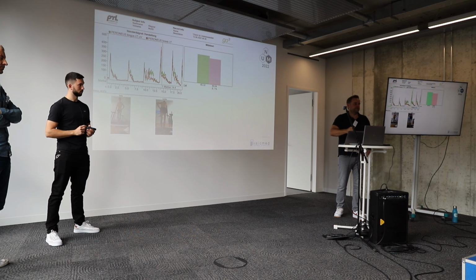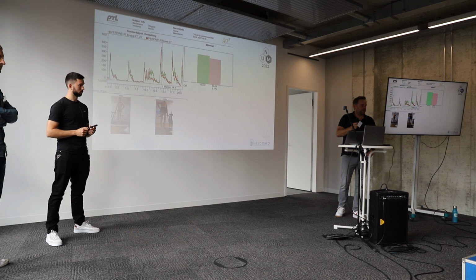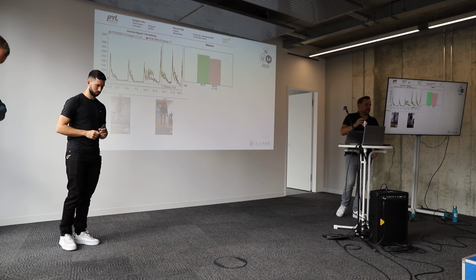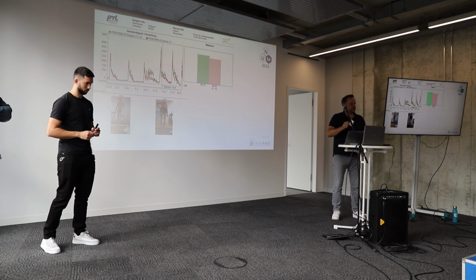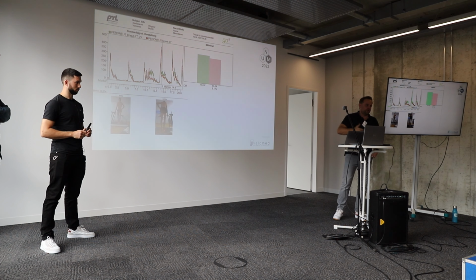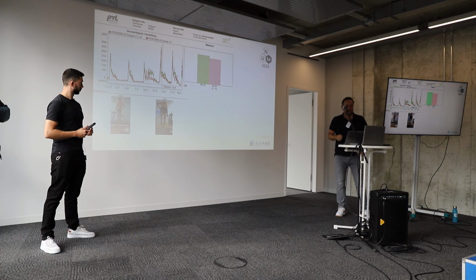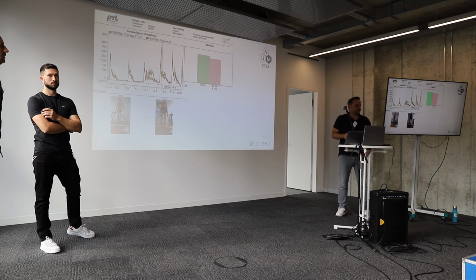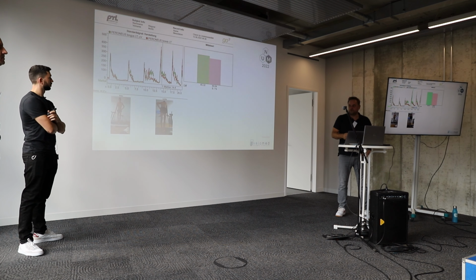muscle to give the ankle a seatbelt and more stability, because it's known that after ankle sprains, the peroneal muscle does not activate the way it should. So that's just a suggestion. I think there will be more science in the future, but I think it's a pretty good tool to support our athletes to get them properly back on the court.